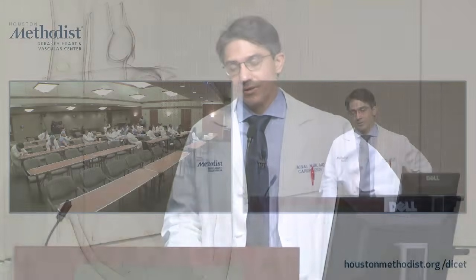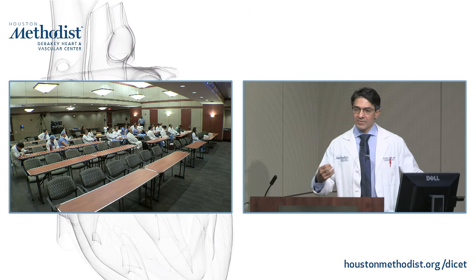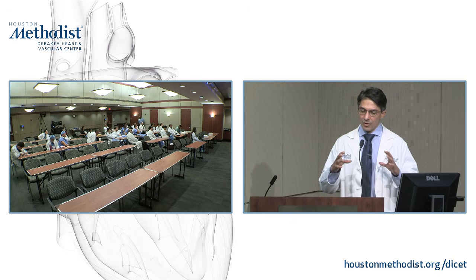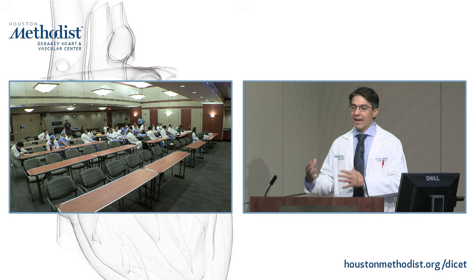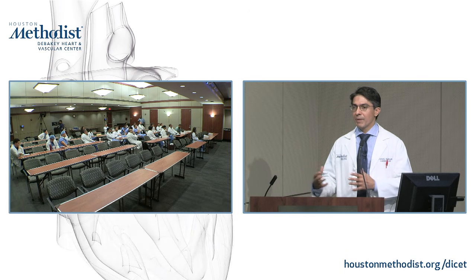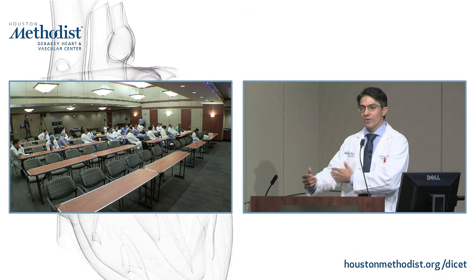So if the patient moves with the test, we're in trouble. We do a very deliberate, systematic approach. The technician goes in there and talks to them in great detail, because they have whole instructions they have to follow. We practice with them beforehand as a way of building muscle memory for when the actual scan happens. One of the biggest sources of problems is when they get that bolus of contrast.